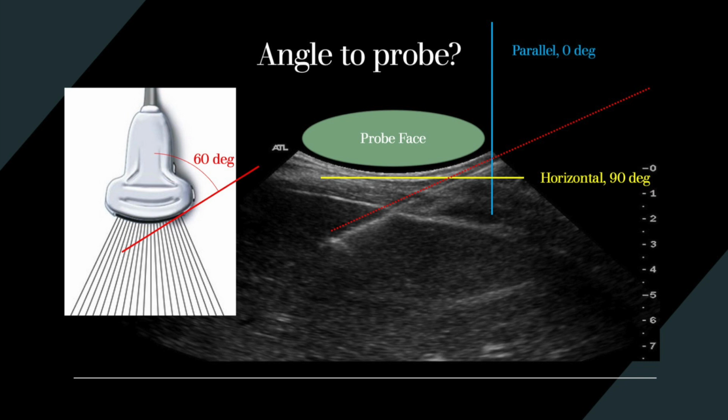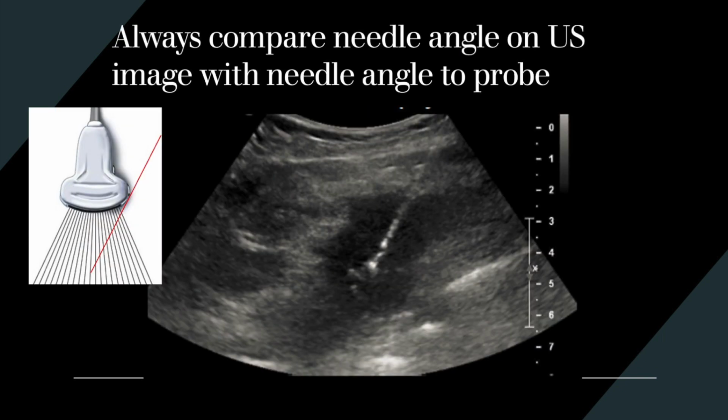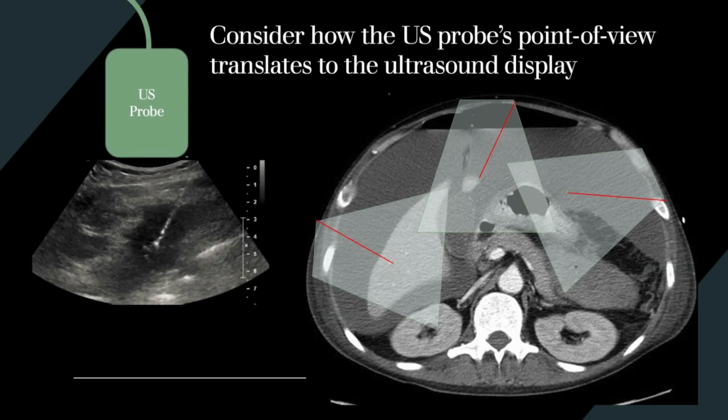On the red line, we can see the needle and where I expect the needle to be and the angle of the needle in relationship to the transducer. Horizontal being 90 degrees with the probe, 0 degrees being completely parallel to the probe. Always compare that needle angle on the ultrasound image with the needle angle on the probe. This is straightforward when the transducer is facing down and at 12 o'clock, just like we see on the monitors. So depending on the orientation and the direction that the transducer is placed on the patient, the direction of the needle can be completely different, despite the fact that the image you're seeing on the monitor is exactly the same.